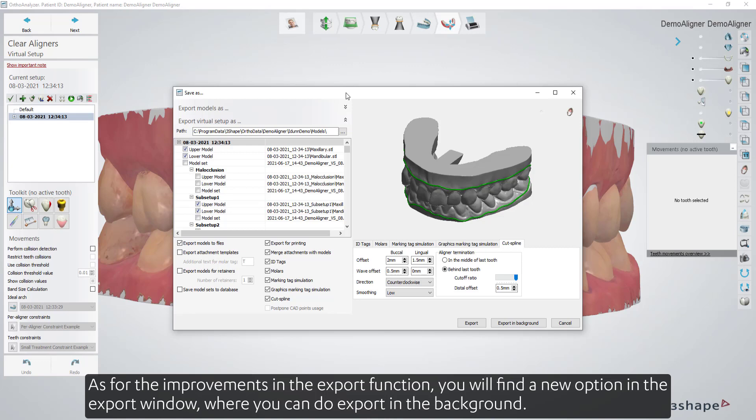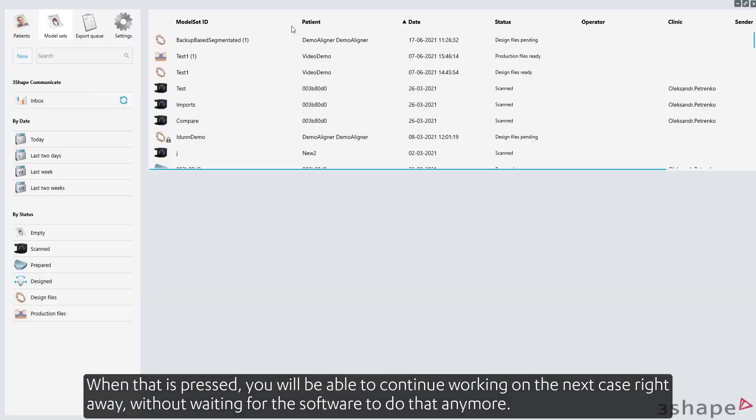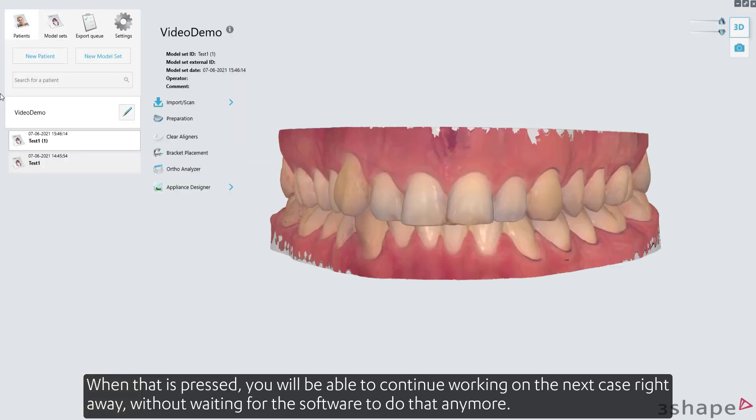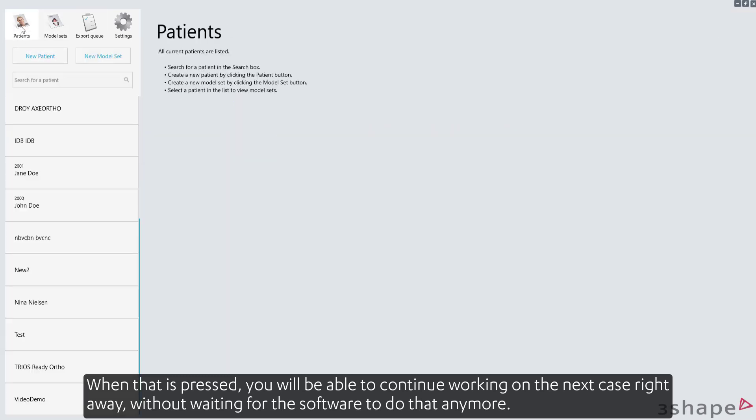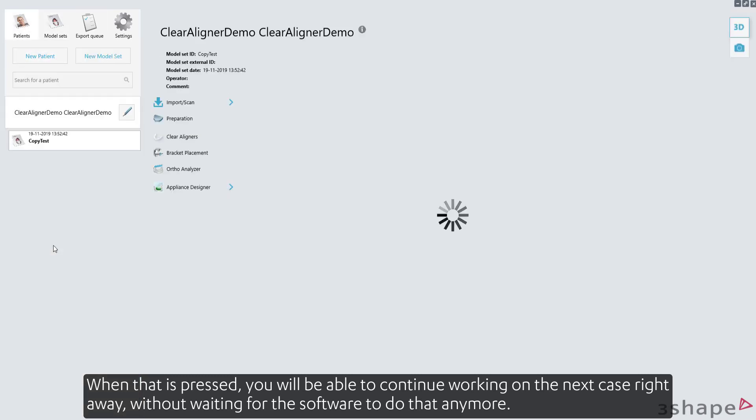As for the improvements in the export function, you'll find a new option in the export window where you can do export in the background. When that is pressed, you'll be able to continue working on the next case right away, without waiting for the software to do that anymore.